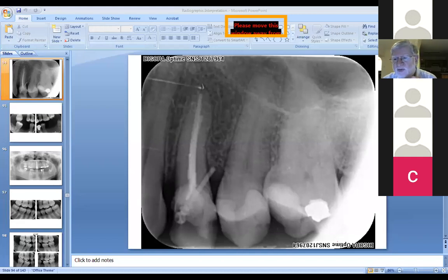In the absence of symptoms, leave things completely alone. The only one of any of those that came out was the guy who had the symptomatic 1/8. He came in, he was uncomfortable, he was in pain. I took the bite wing, it didn't go far back. I took the PA, which now captured the 8, that led on to the OPG, and he had that tooth removed. Fortunately, it didn't have fancy mangled roots, and that was removed by the oral surgeon.